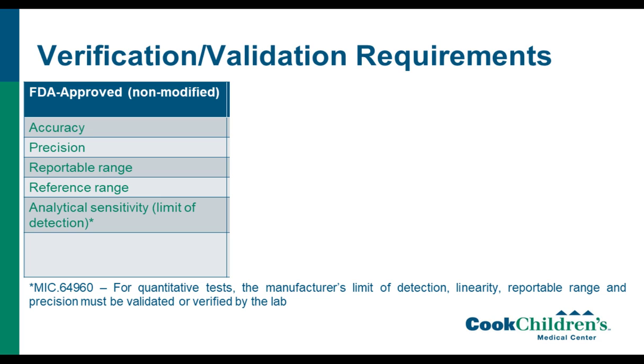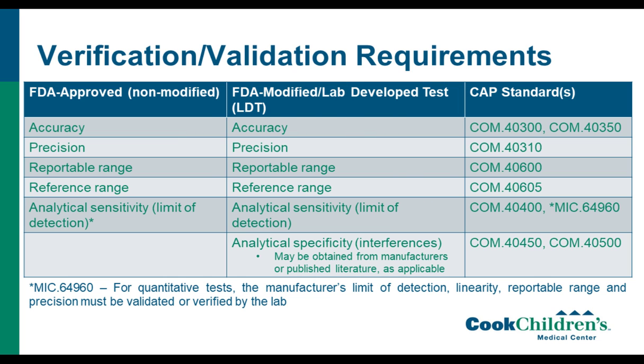Now, as far as defined actually by CLIA, you don't have to do analytical sensitivity, but CAP has said that for quantitative tests you actually do have to do the limit of detection, so that is an extra requirement for CAP.